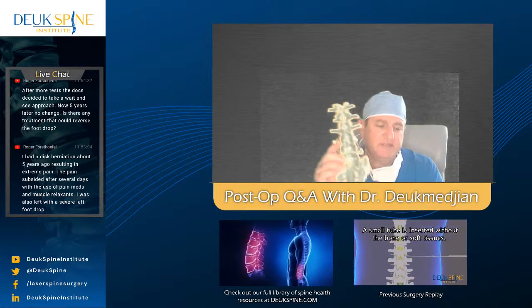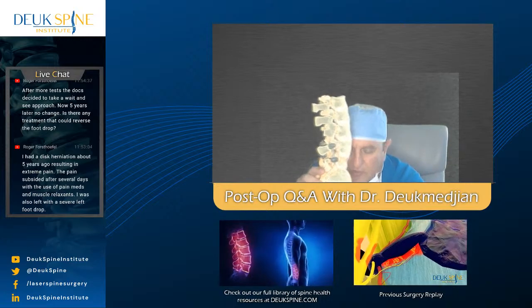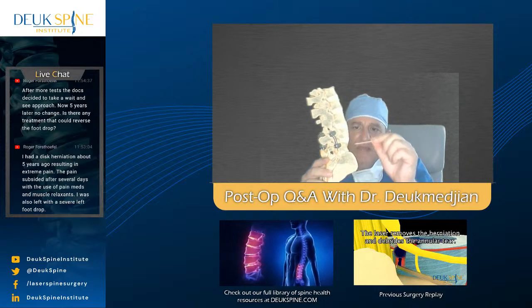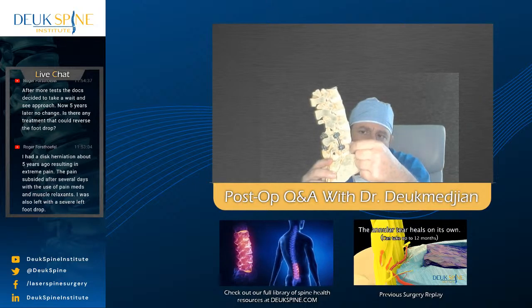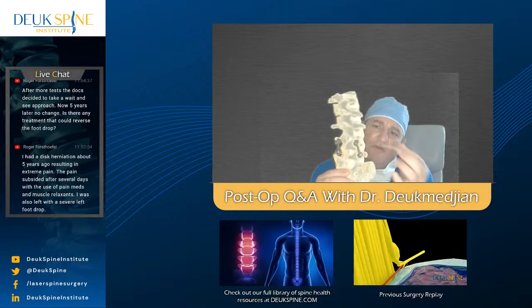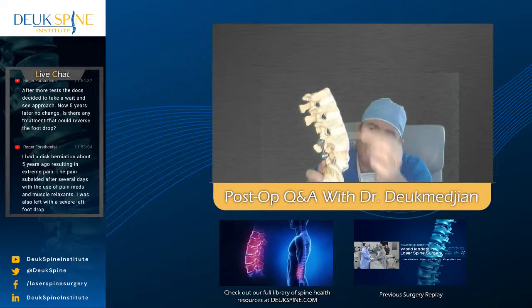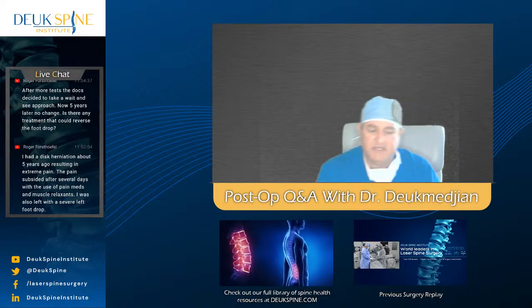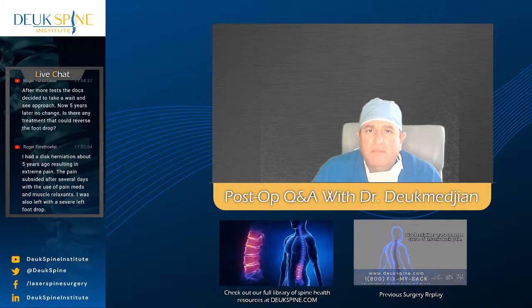Just so you understand what that means, by a transforaminal approach, we are fixing the herniation by going through what's called the foramen. That's the foramen, and the reason why L5-S1 is so difficult is because there's an iliac crest here, a bone that's not part of this model, and you might hit it, and then you have to get in and fix the herniation there, okay? So most endoscopic surgeons do L4-5, which is this one, the next disc up, and above, up to about L2-3. So they do these 3 discs. We do all discs at Deuk Spine. We don't discriminate based on the location of the disc, and I've been able to get into L5-S1 almost every single time. There have been a couple of exceptions.